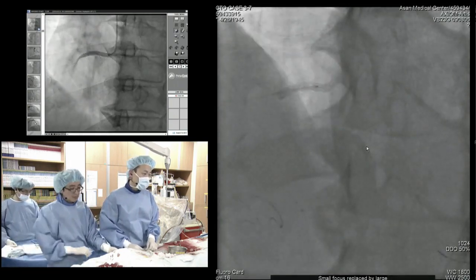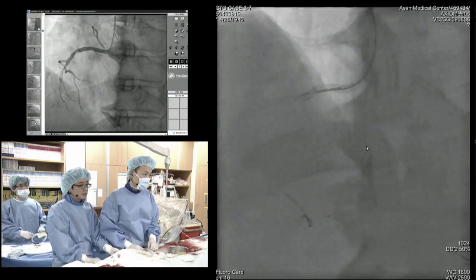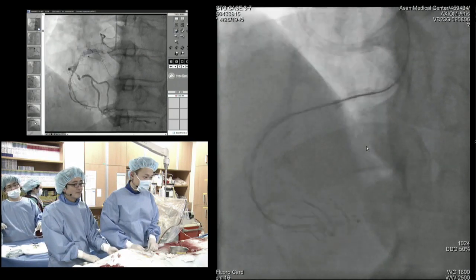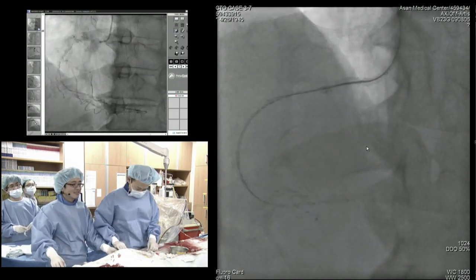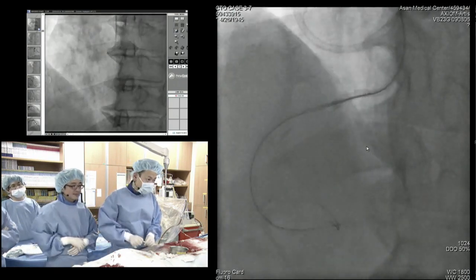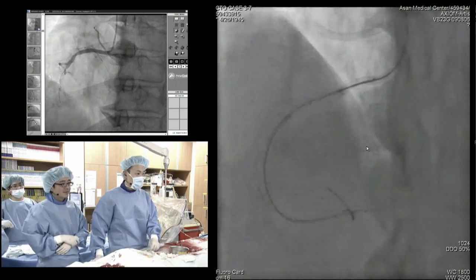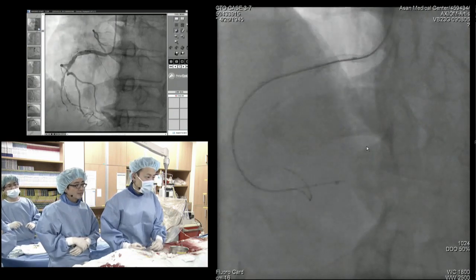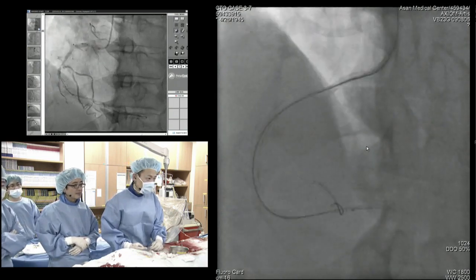I explained the name of Sasuke. Sasuke is a ninja. Do you know ninja? Ninja turtle. So what is the profile? This one profile, 2. Profile almost 3 French.